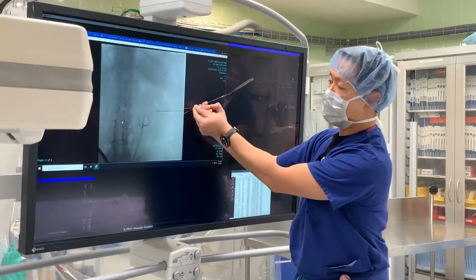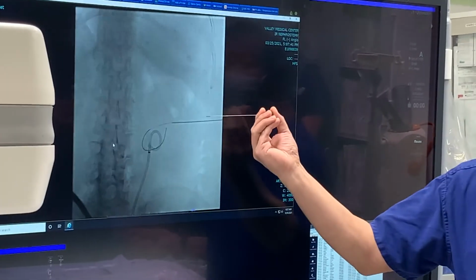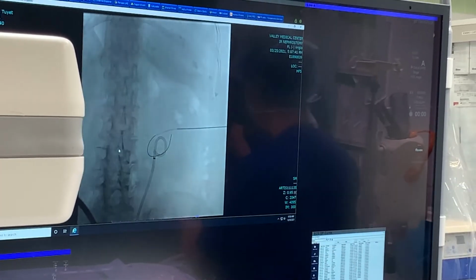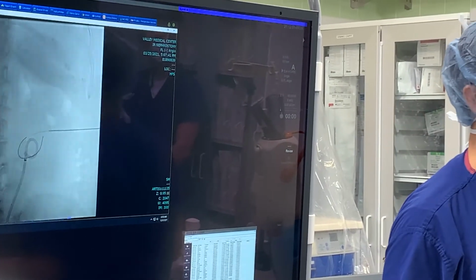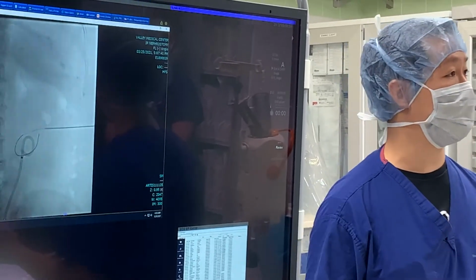Okay, so here's a stent, this needle followed by this wire, okay? The things that we are thinking about in our mind when you put this in: how sure am I that I'm in the kidney? You think you're in on ultrasound, you poke it, you open this up, urine doesn't come out. Is it because you're not in? Is it because the urine's too thick? Is it because there's blood? We don't know. What can you do?